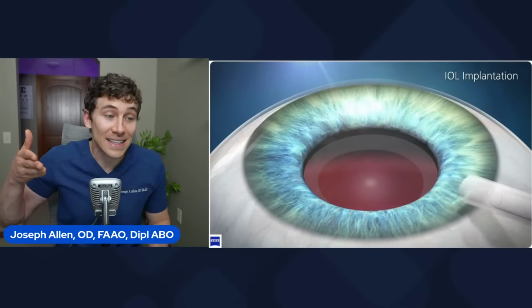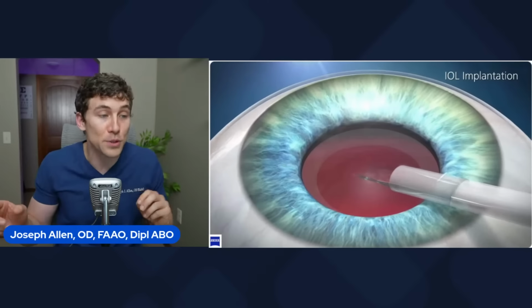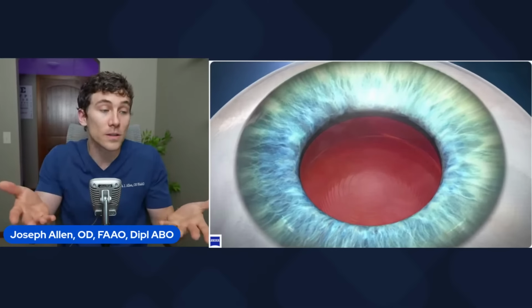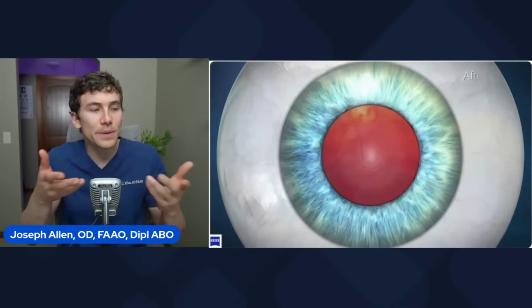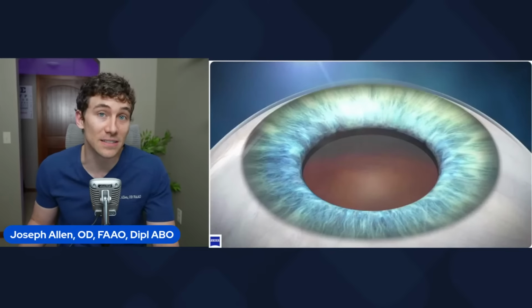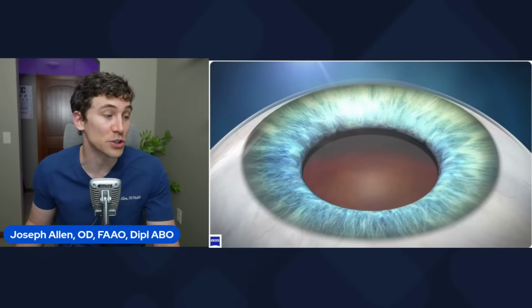put a lens into the eye. This is the implanted kind of lens option that goes inside the eye after cataract surgery. It's folded up like a taco, and when they release it, it unfolds and sort of locks itself into place. And if it's a little bit out of position, your doctor can rotate it and move it in the correct spot. But once it's in place, the surgery is done, and takes about 10-15 minutes usually at most. It's pretty amazing how fast and efficient they are at this procedure.